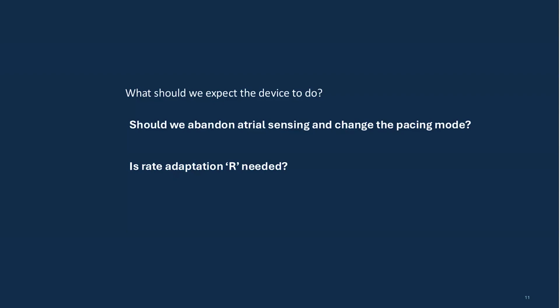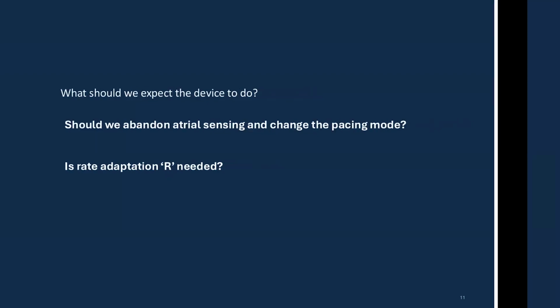The rate response is very sensitive, so we will adjust the rate response parameters. In this ECG the rate response is activated but needs to be adjusted. Okay. Yes. Okay.